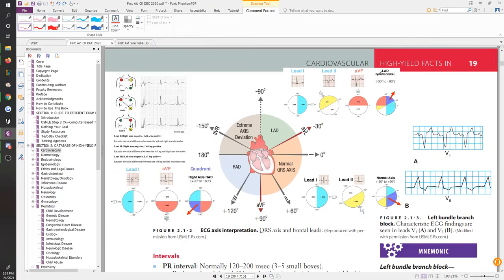Now, in a pathological person, the blue didn't change. So that's why your lead 1 is still pointing up over here, and it's still pointing up over here, in both the normal axis and the left axis deviation. But your yellow has literally gone the opposite way, right? So now instead of the bottom half being yellow, the top half is yellow. Here, lead 2 was pointing up in a normal person, but in a person with LAD, left axis deviation, lead 2 is pointing down.